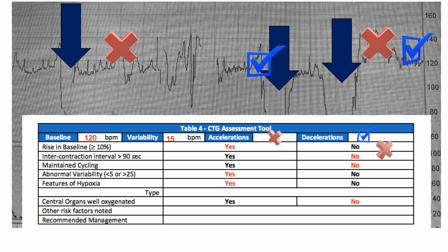There has not been any catecholamine response because despite the decelerations, the baseline has remained at 120 beats per minute. You could also see the alternative episodes of reduced and normal variability, which is called cycling, and it denotes the active and quiet sleep phases of a healthy fetus.